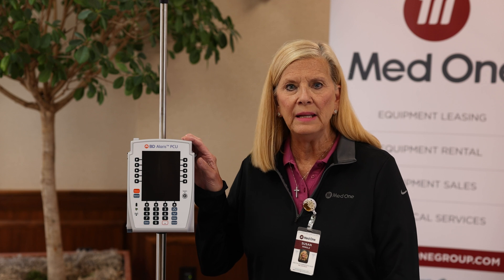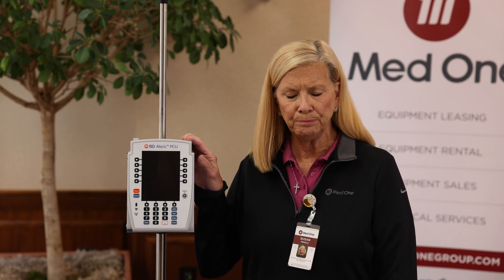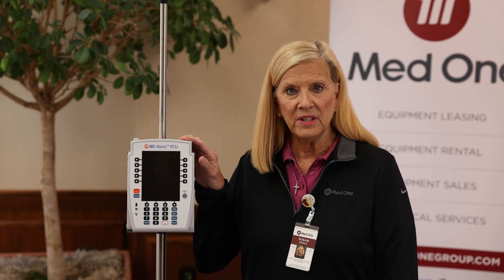What I have here is what's called the model 8015 PCU, which stands for point of care unit. By itself it does not do anything — you have to attach one of the modules for it to run. It can hold a maximum of four modules per PCU.